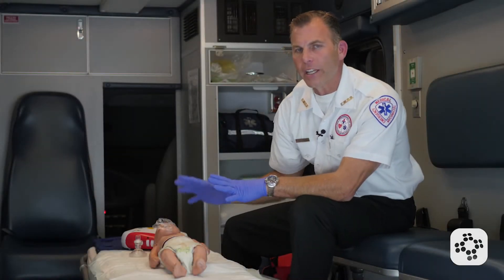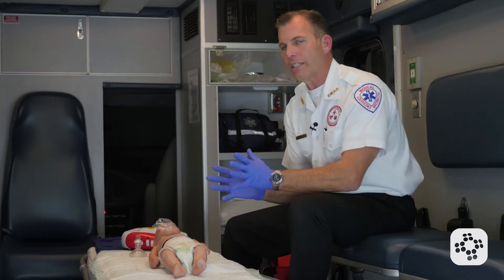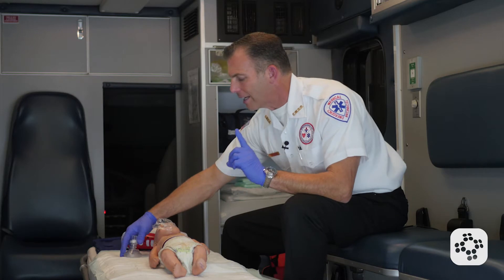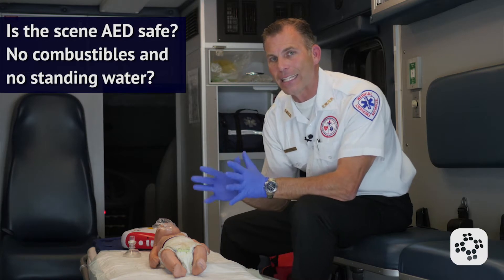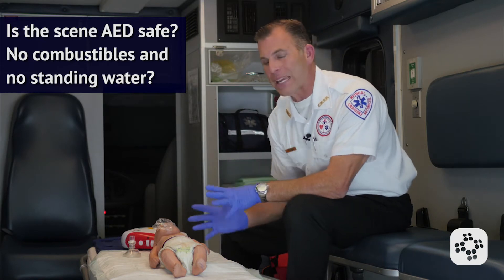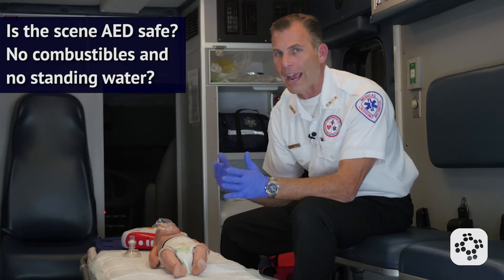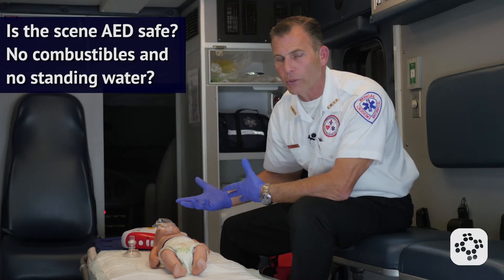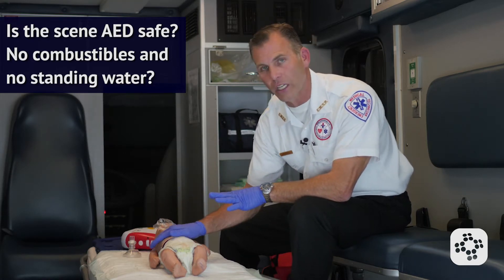Now let's cover the use of an AED on an infant for the healthcare professional, one rescuer. The scene has been deemed safe, gloves are on, and a rescue mask with a one-way valve is available. Because we're using an AED, we also check that the scene is AED safe — no combustible gases or liquids nearby, and the baby is not lying in standing water that connects them to us, as we don't want to become accidentally electrocuted. If they're in a puddle, we move them to a drier area and dab them off so the electrodes will stick to their skin on chest and back.